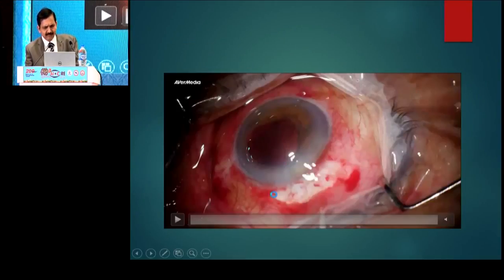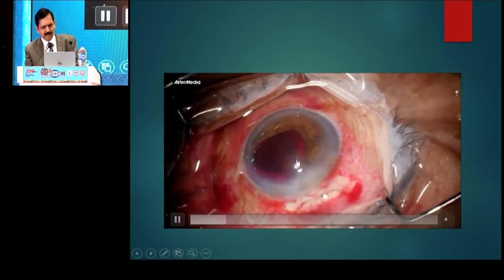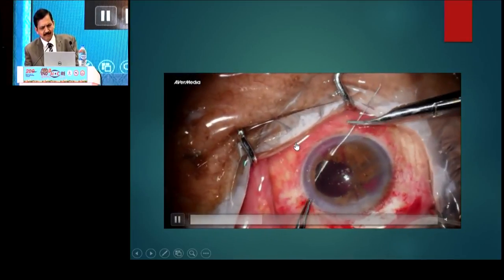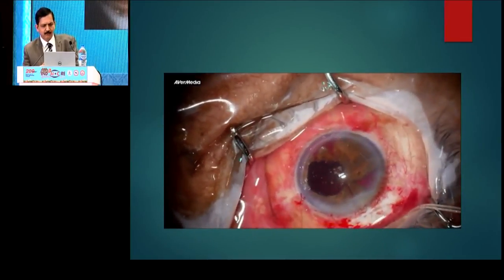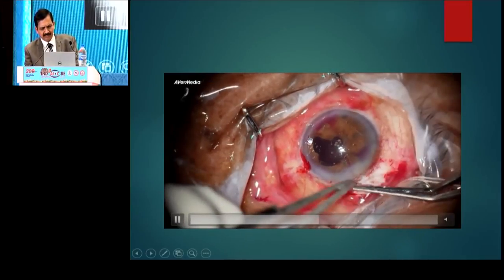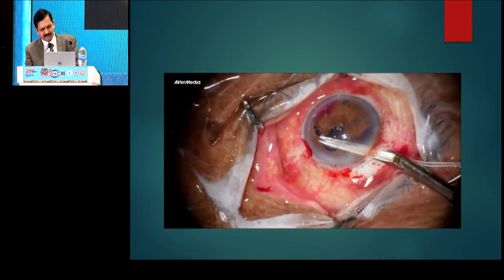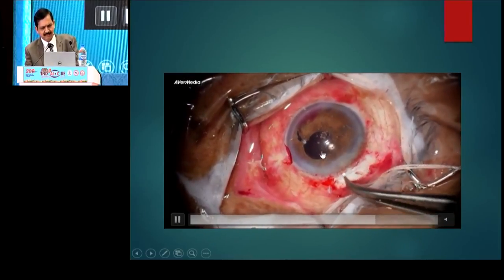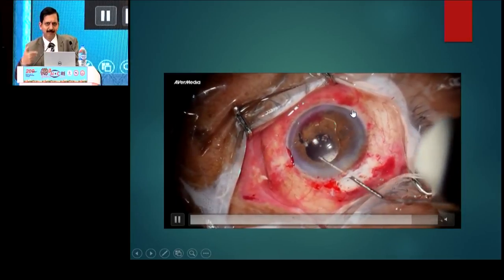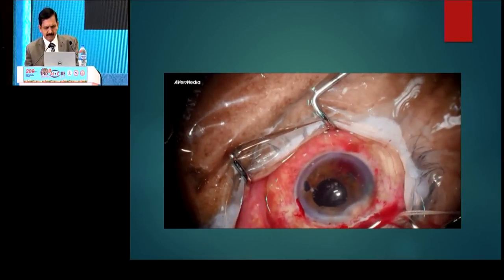This is another case where there was an IRIS defect following the initial surgery. Even after putting pilocarpine in, there's still a defect. So I'm suturing the IRIS here using 10-0 proline — just pull out the free end, make a loop, then three throws clockwise and pass the knot inside. Now you've got a nice round pupil. The side ports must be made exactly where you are going to tuck the IRIS, and this way it can be done in any direction.